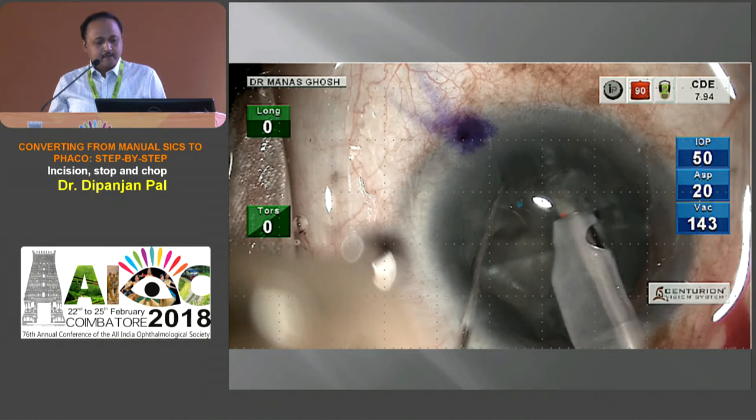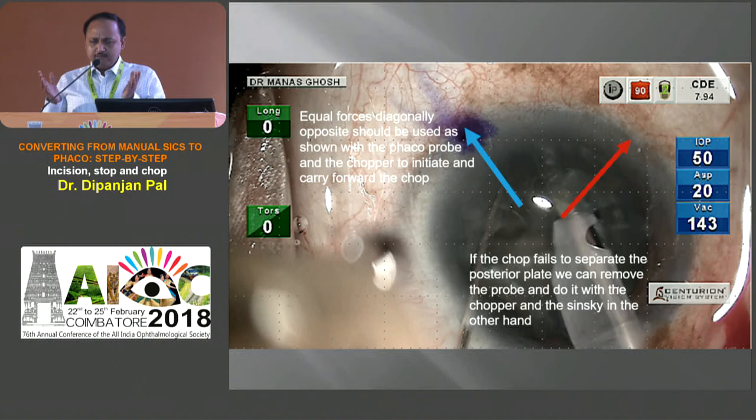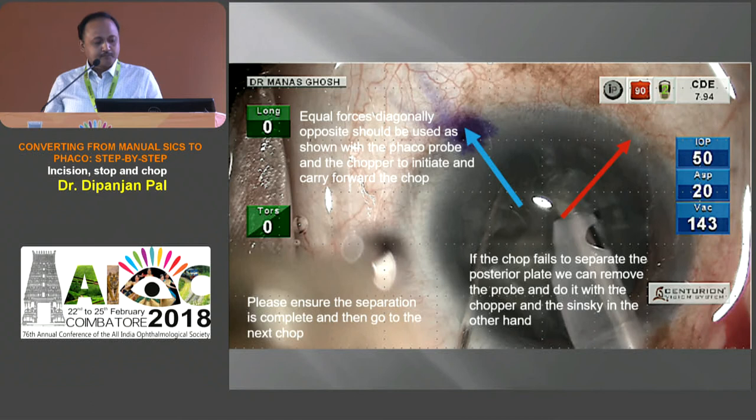See how we are initiating chopping — the hold is perfect and we can initiate the chop. While chopping, we deliver equal forces diagonally opposite: the phaco probe and the chopper initiate and carry forward the chop. If for some reason we cannot get a proper chop and the posterior plate is not separated, we can remove the probe — as Dr. Bhattacharya was telling us, visibility is better — and use two instruments like two Sinsky hooks or one Sinsky and one chopper to have a proper crack. We need to ensure the separation is complete before going for the next chop.